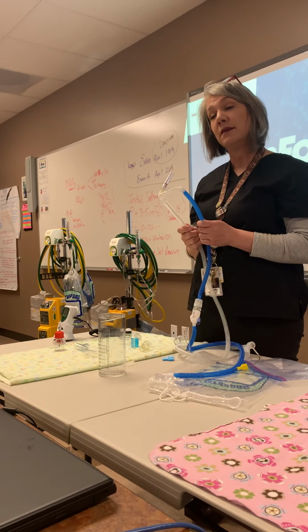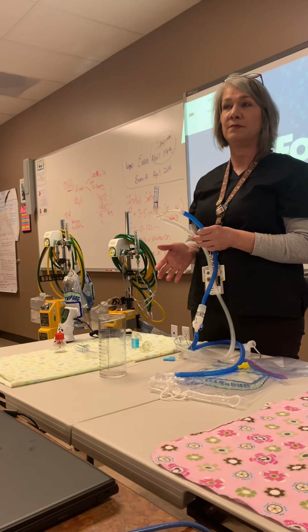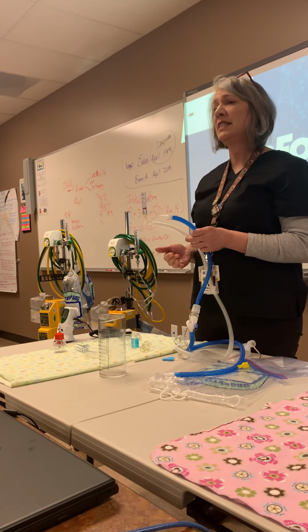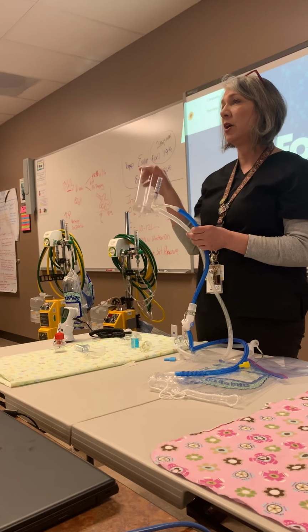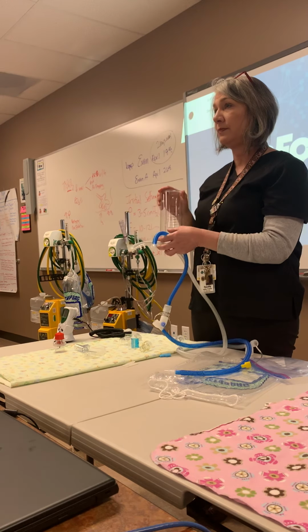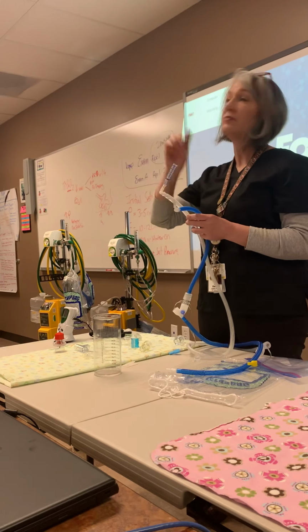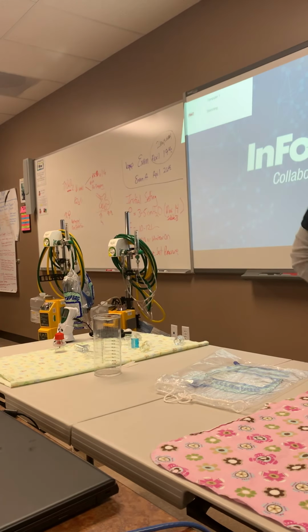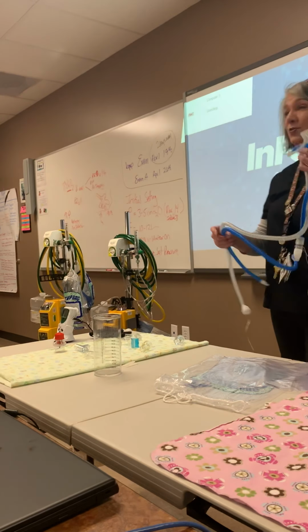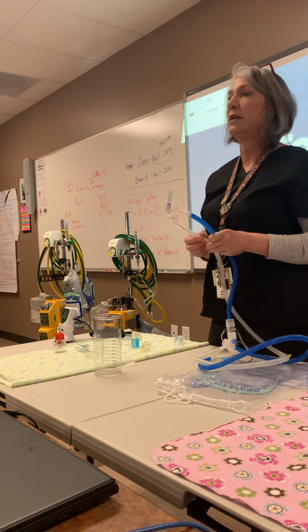Next, measuring tape. Anybody not know what a measuring tape looks like? If I had a sterile water bottle, I could measure up the centimeters by just incrementing the pressure on the tape measure. All of your L&Ds are going to have a tape measure. Why? To measure the baby's head, and how long your baby is when they're born. If you're 19 inches long, that's how we got the measurement.